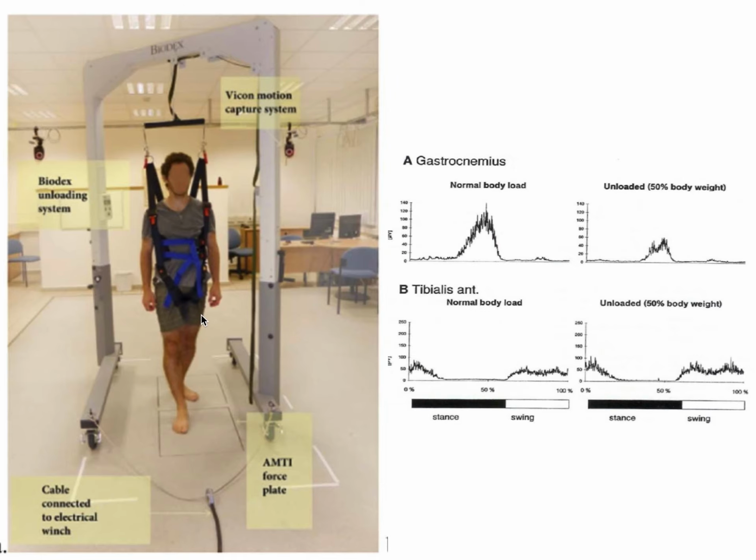So he's going to walk, and then they use the harness to unload the body weight 50%. So they study gastrocnemius and tibialis anterior muscle activation pattern during walking with normal body weight load and 50% body weight unloaded.